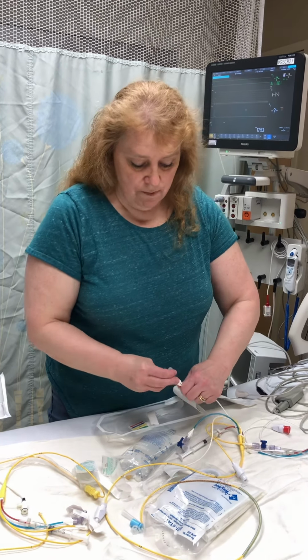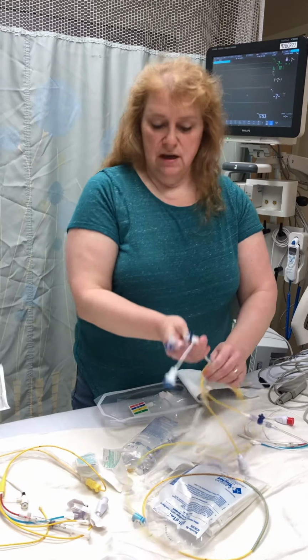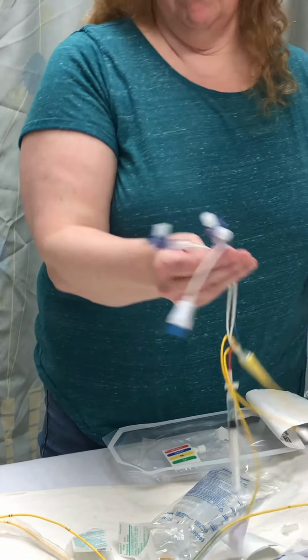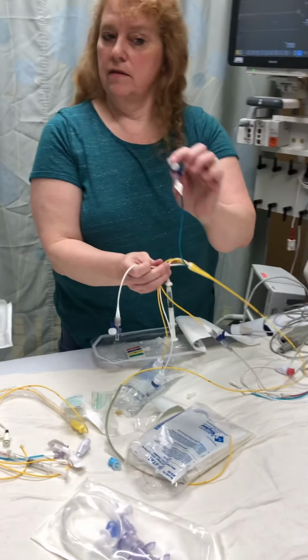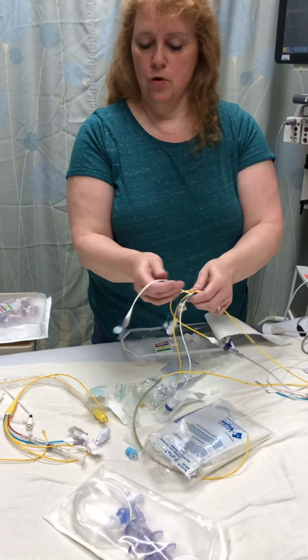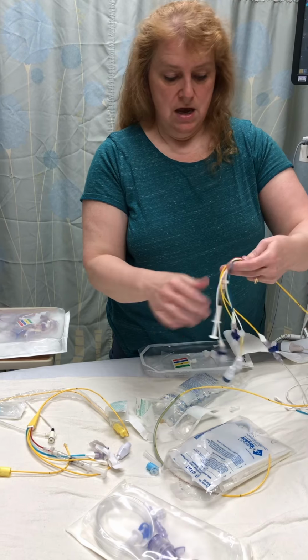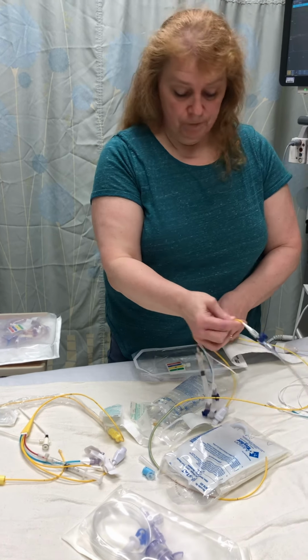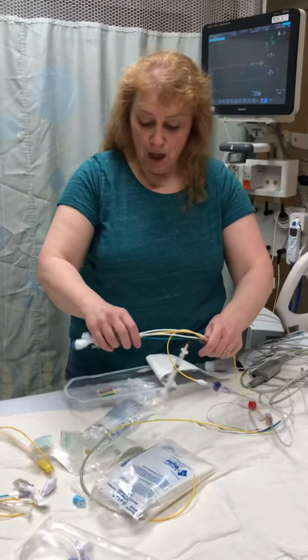So you need to make sure you're putting in the appropriate things in here: the TKO line, your code blue port, your vasopressors, and then in this will be only the pressure tubing. Only the pressure tubing.